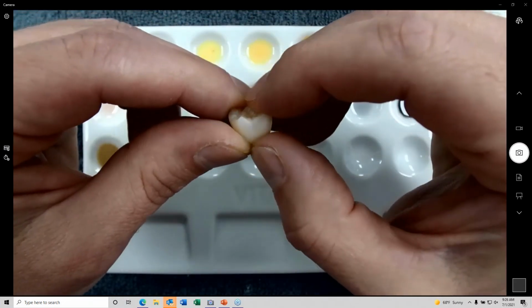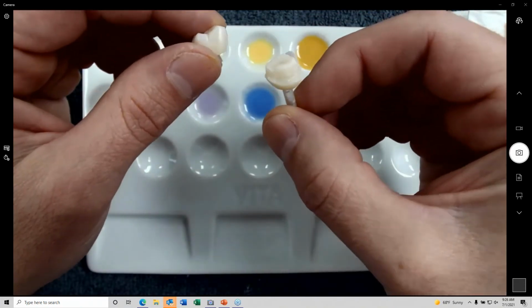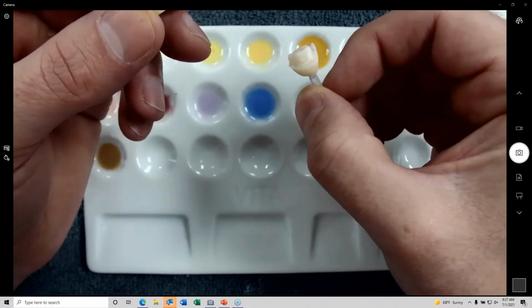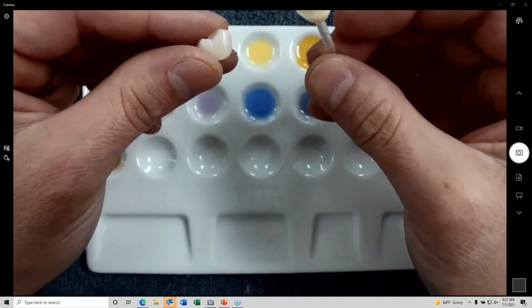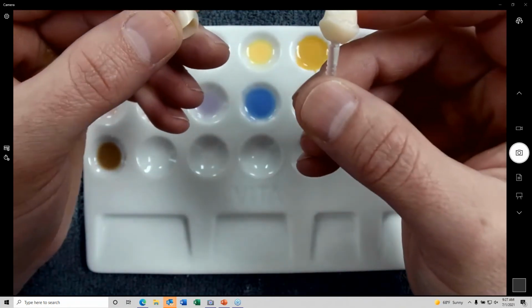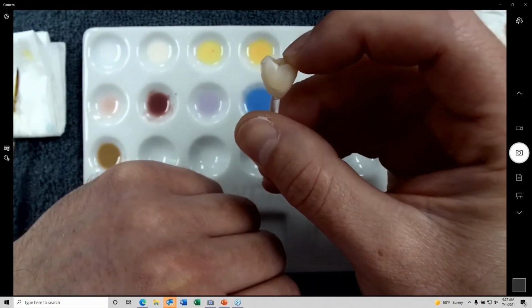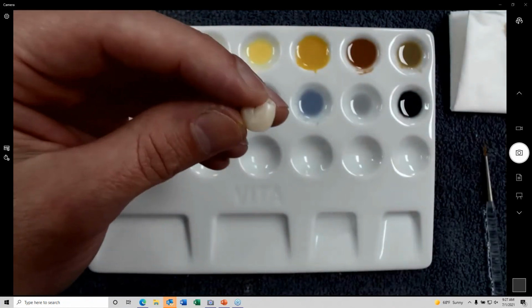I got a question. What material are you using to create the core substructure? Oh, sorry. This is our VMLC. It's just light cure composite. Our VMLC comes in the VITA 2 shades. So, if this is an A1, I'm going to do an A1 core or an A2 core or whatever core represents the stump shade. That way I know what it's going to look like when it's in the mouth. Sorry, yeah, our VMLC, our light cure composite. That's what I made that core out of.